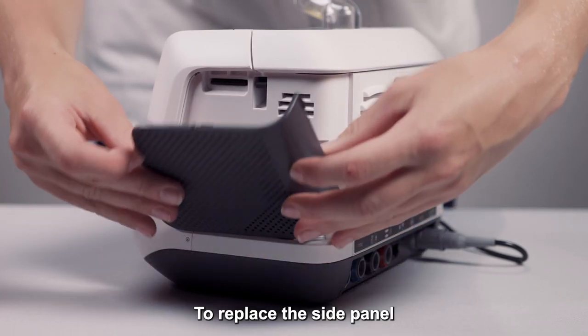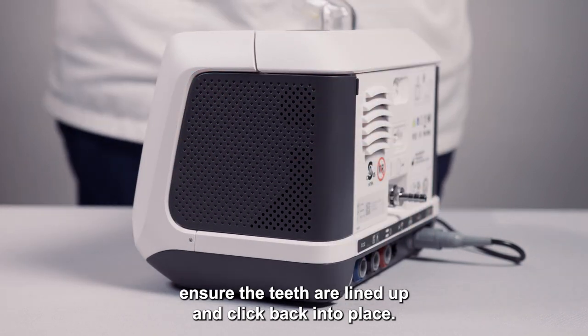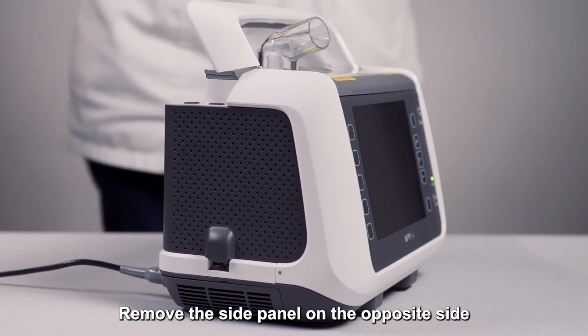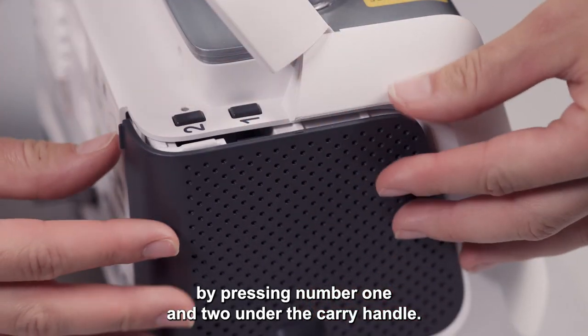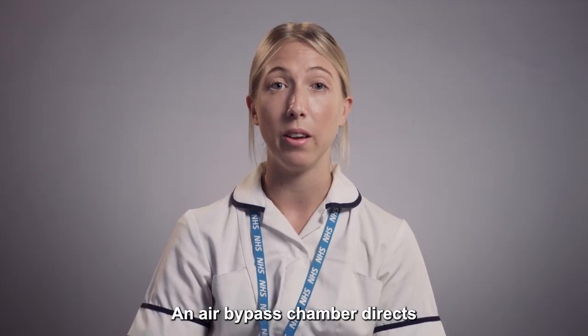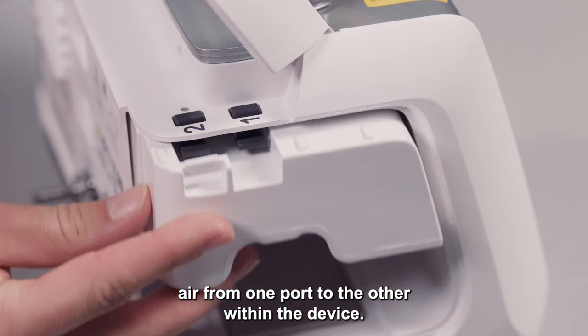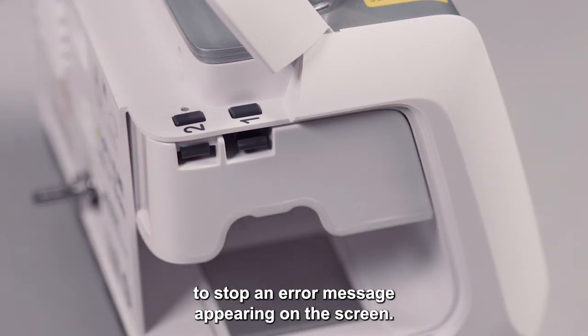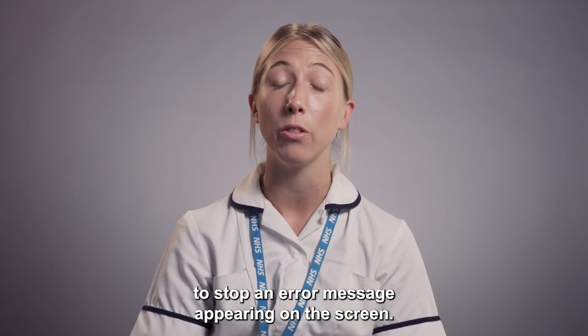To replace the side panel, ensure the teeth are lined up and click back into place. Remove the side panel on the opposite side by pressing number one and two under the carry handle. An air bypass chamber directs air from one port to the other within the device. Ensure this is fully clicked into place to stop an error message appearing on the screen.